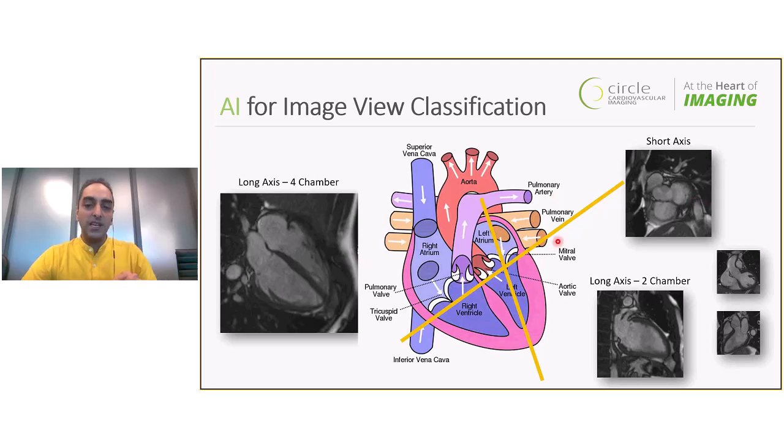And the purpose of this is to slice the left and right ventricles along the short axis of the heart. So you can think of it as like the horizontal axis, right? So if the left ventricle is a cone-like shape, when we slice it this way, the left ventricle would look like a circle. And you can see the left ventricle right there. This particular view is extremely important because the cardiologists use this view to measure the volume of the left ventricle. And to measure the volume, they typically acquire more than one short axis slice.